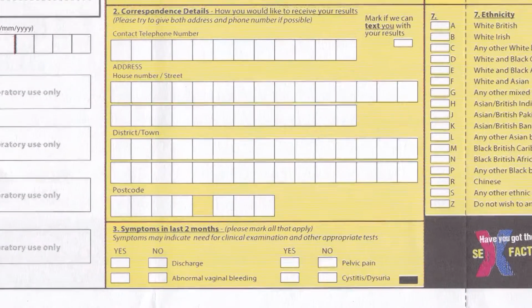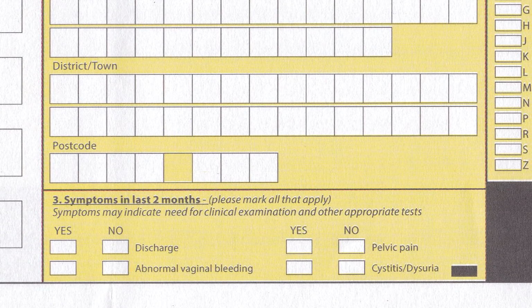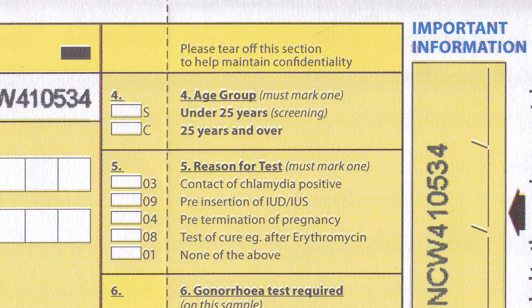Then at the bottom, there's some little questions about whether you have discharge, abnormal bleeding. Tick those. If it's yes or if it's no, give it a tick. Then down the side, there's just some demographics about age. So if you tick those where appropriate, then you'll have your NCW number. Now this you need to date with your date of birth, and one will go on your bottle.